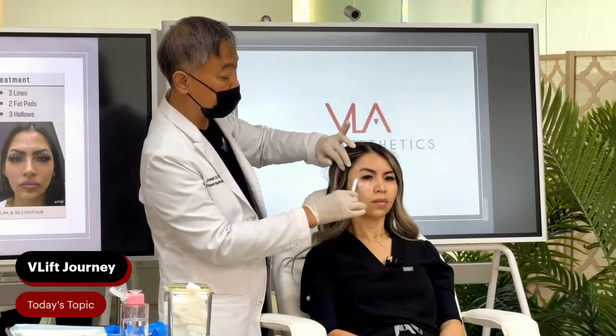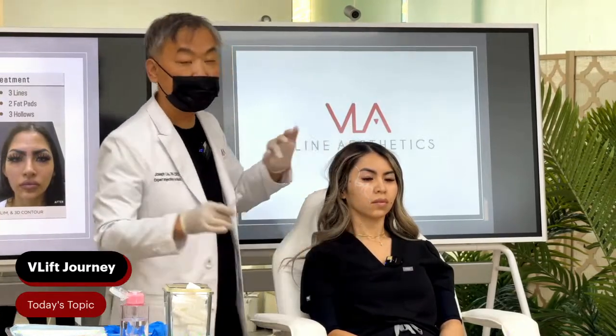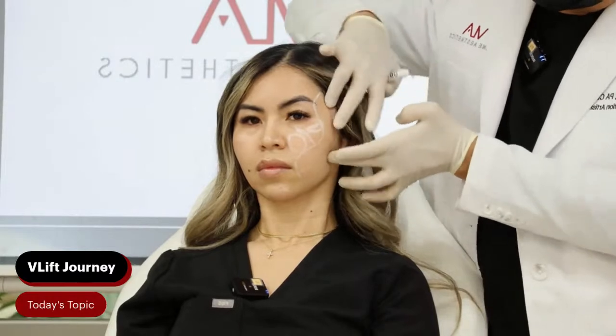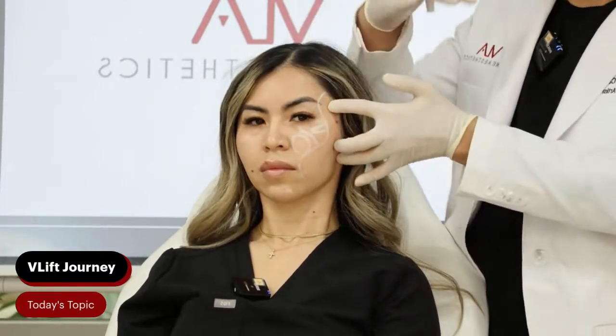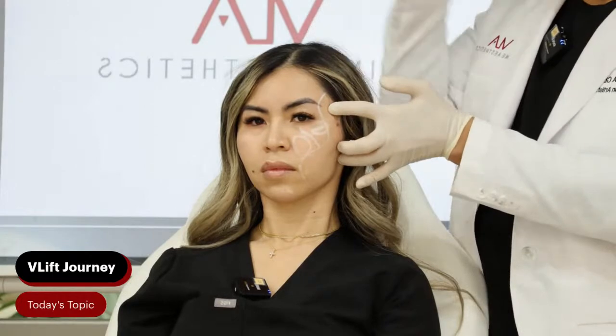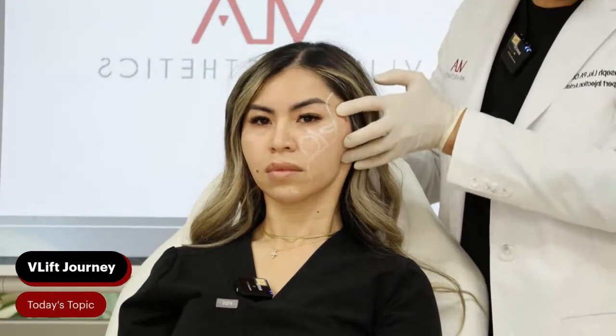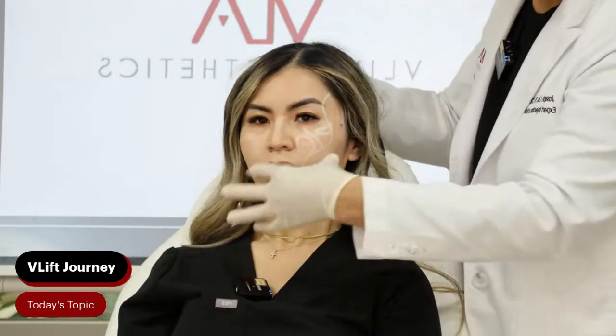Before we move on to the next one, I will say that we usually break up the face into 2 portions, lateral and medial. And the VLift technique is fixing the face from the side using fillers. What that means is we use fillers in the back, on the side region, here, here, here. As filler volumizes, it actually lifts the middle portion. Volumize here to lift, that's the key concept. To lift the fat pad in the middle, we put filler on the side to volumize it.